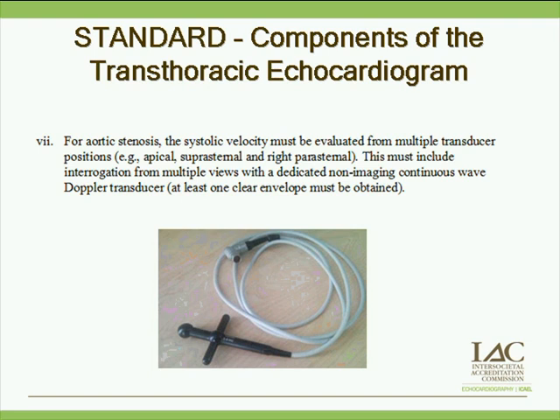And I think many times, and again, we see this daily, sonographers will use their imaging probe. They'll get a nice Doppler from the apex, and they call it a day. Okay? Well, you're doing your patient a huge disservice because you have no idea which way that AS jet is going.